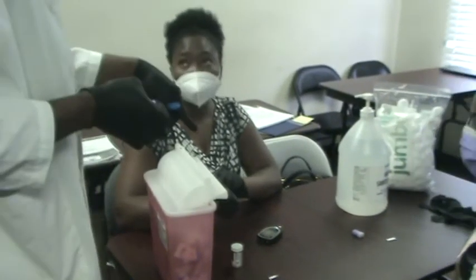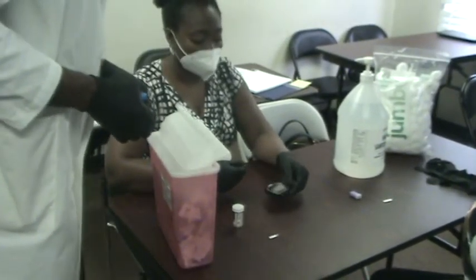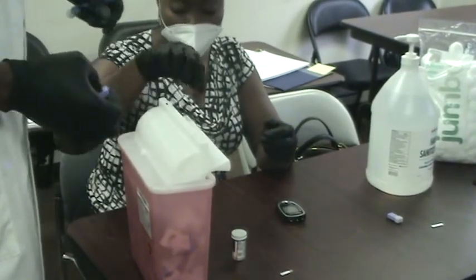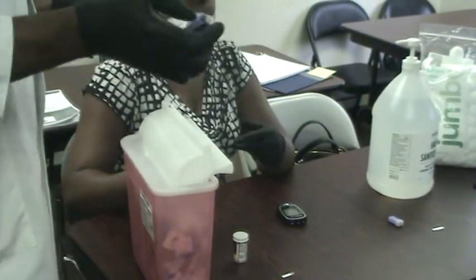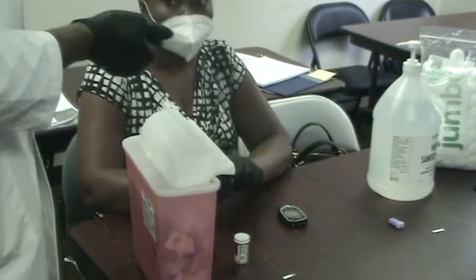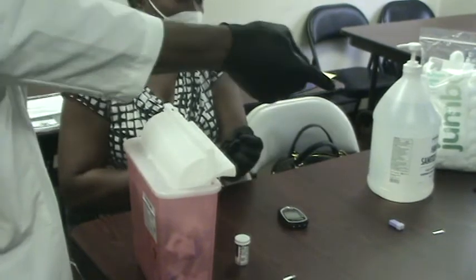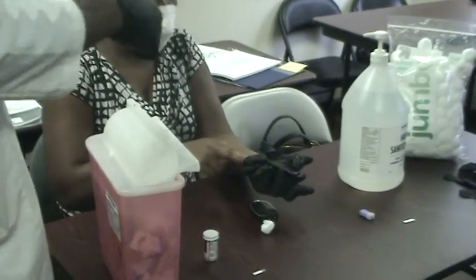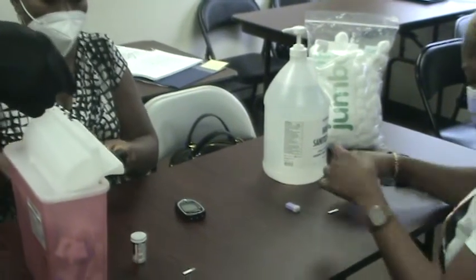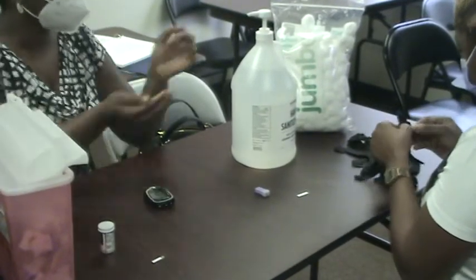So you would take that off. Take the strip off. Where is the needle? So put that in here. And then the rest can just go in the trash can. So just put everything in one glove, then unfold it. Alright? You can get hers too. Then, so it's your turn now to return the favor. Right?